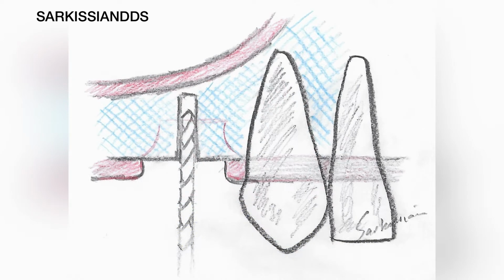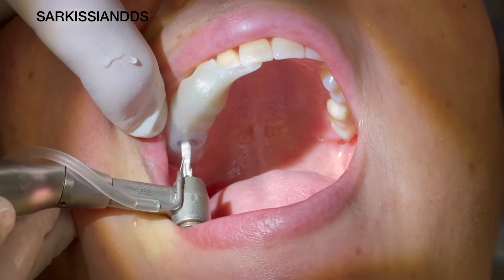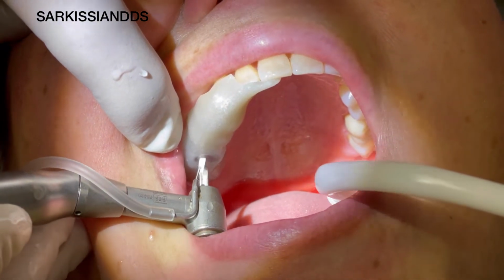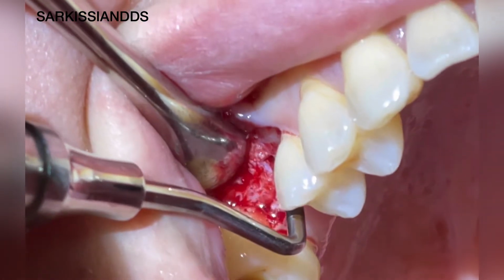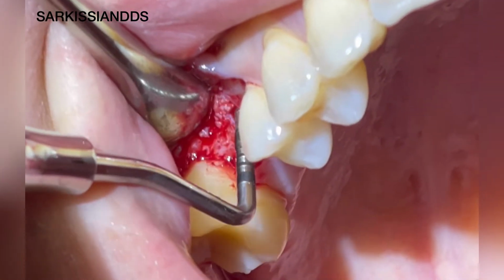After laying a conservative flap with the ultimate intent of displacing keratinized gingiva to the facial of the implant, I start the osteotomy through the guide and stop at the predetermined D2 depth, which I established with my cone beam study. I remove the guide and probe the base to make sure I have hard bone and have not perforated.